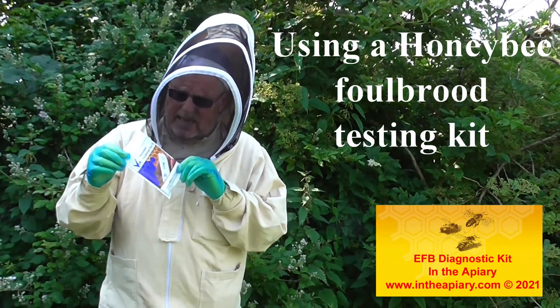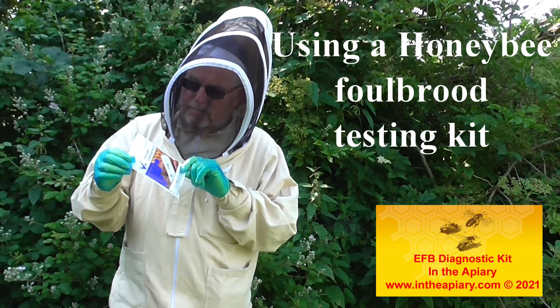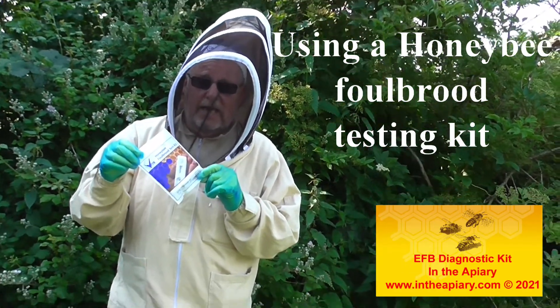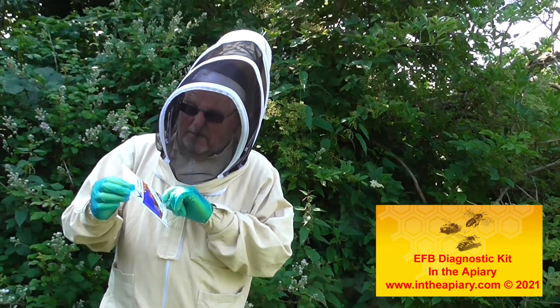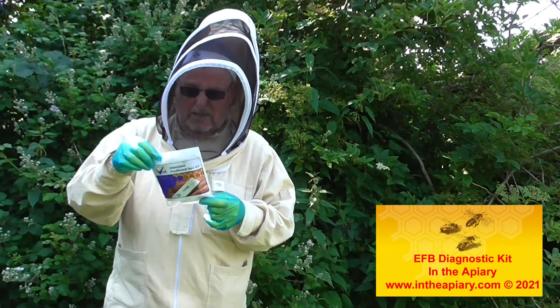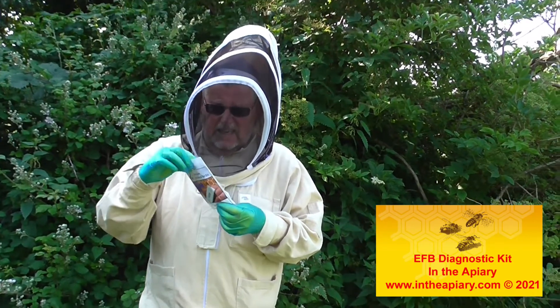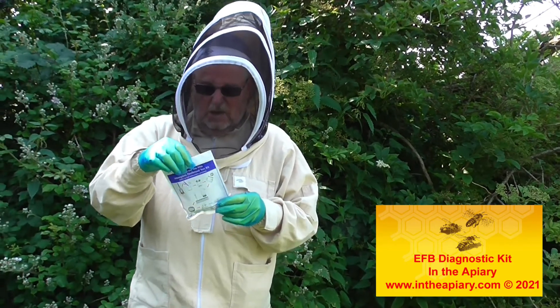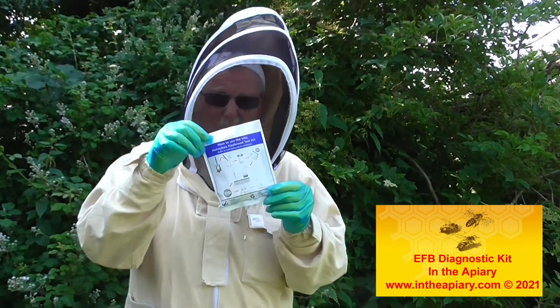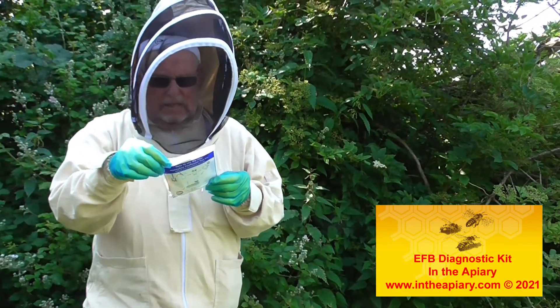What I got here today is a proprietary foul brood testing kit for EFB. This is manufactured by Vita. I think it was just about ten pounds to purchase. It's got everything in it that you need to use to conduct this test. I'll put a few photographs up on the film clip in a second.